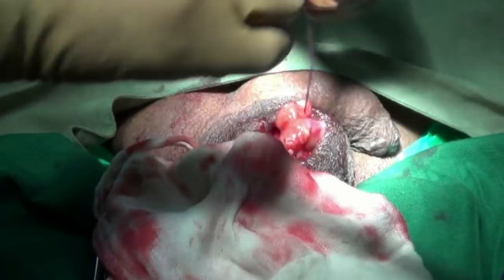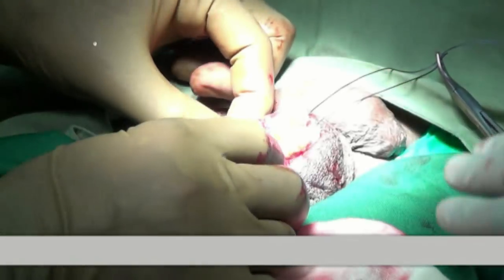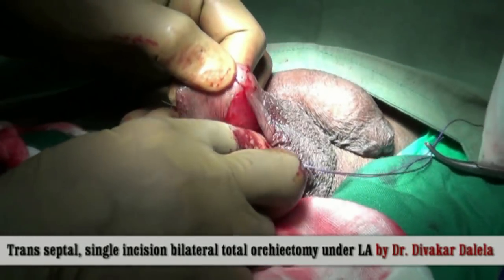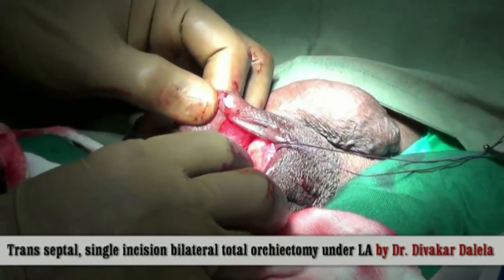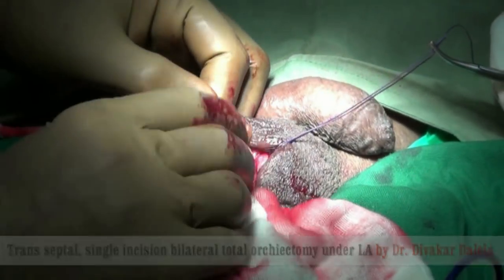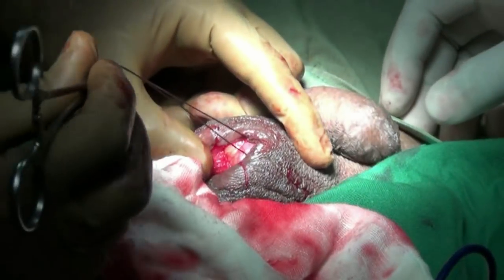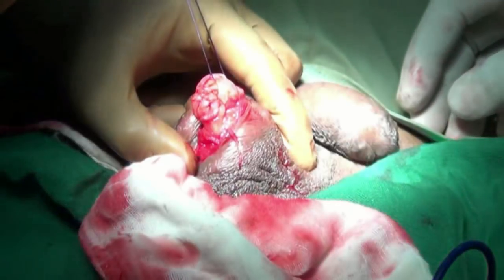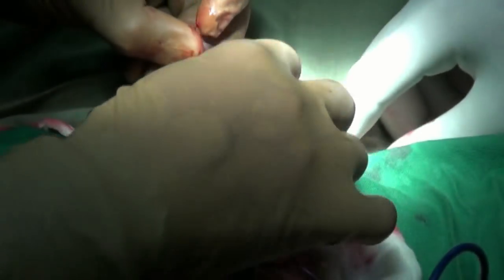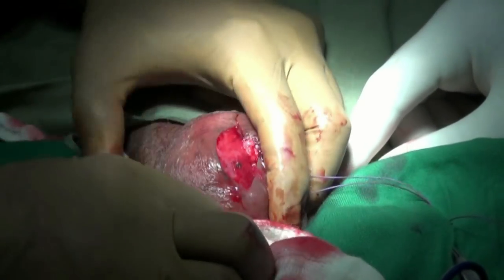Now you can let them go in, but it is a good idea to put a hold and see — let them go in and check whether the relaxed ends are bleeding or not. Sometimes it happens that when you pull them out under the tension of stretch the cut ends don't bleed, but when you relax and let them go in they start bleeding. So pull them out again, examine for any bleeding — there is no bleeding, you can let them go in. So this side is done. Now we proceed to the other side: the other testis is made prominent like this.